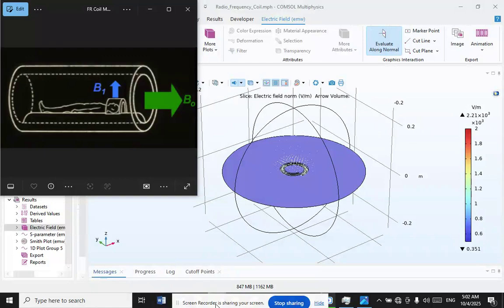These coils require a great deal of RF power because of their size. So they are often driven in quadrature in order to reduce the RF power requirements by a factor of 2. The condition to attain a high RF magnetic field homogeneity is to approximate a spatial cosine current distribution in a radio frequency coil. The RF homogeneity of volume coils is highly desirable for transmission, but is less ideal when the region of interest is small. The large field of view of volume coils means that they receive noise from the whole body, not just the region of interest.